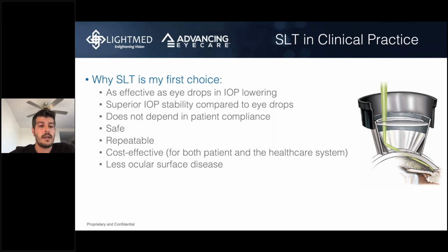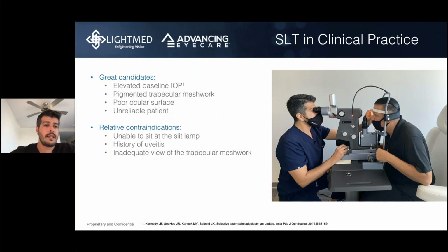It's very safe. It's repeatable. It's definitely cost effective for everyone involved, for the doctor, for the patient. Imagine all the copays and money that they have to spend on the eye drops, and the healthcare system as a whole. And you get less ocular surface side effects, which is the part that I really care about as a cornea person. So who's a great candidate?